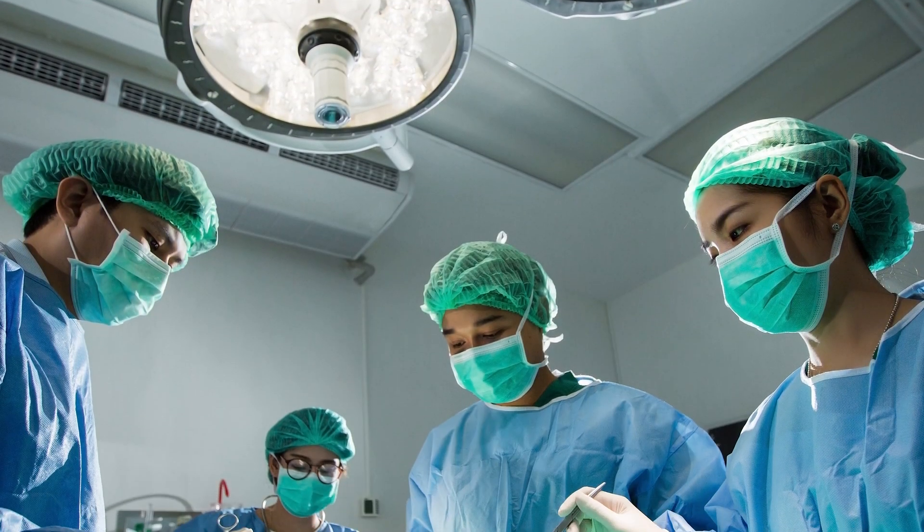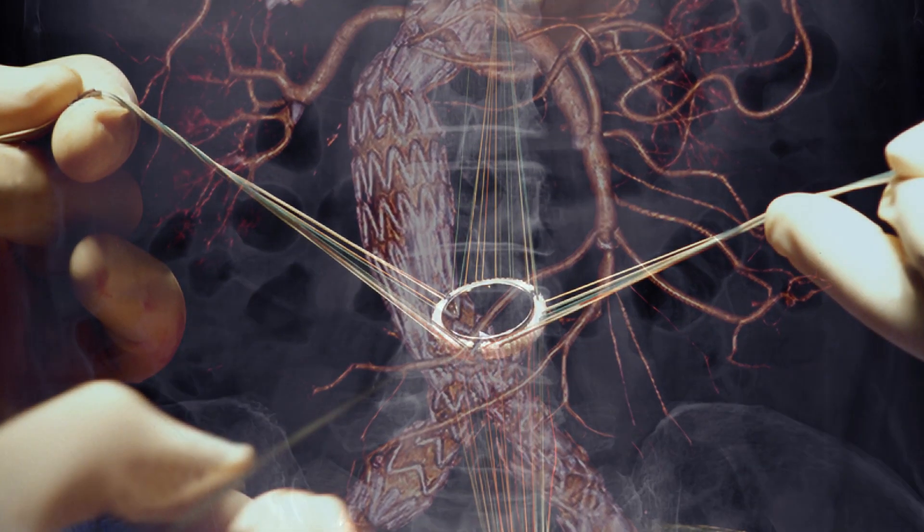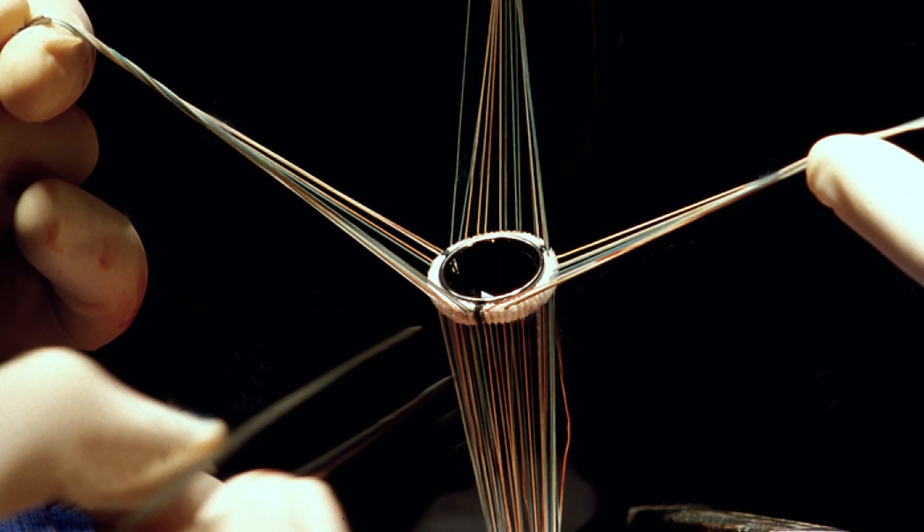There are approximately 400,000 coronary artery bypass grafting procedures performed in the U.S. each year. Commonly, these tissues are replaced by one-size-fits-all solutions that do not fit patient-specific needs.